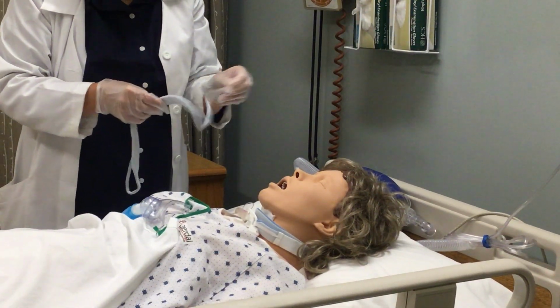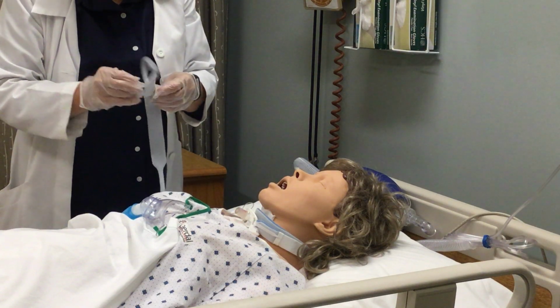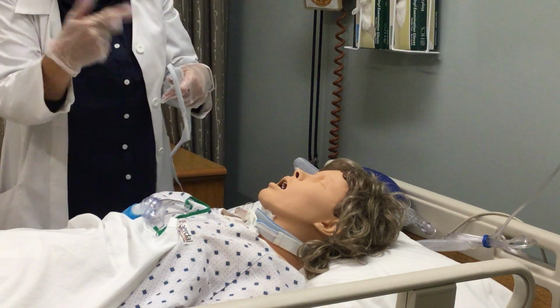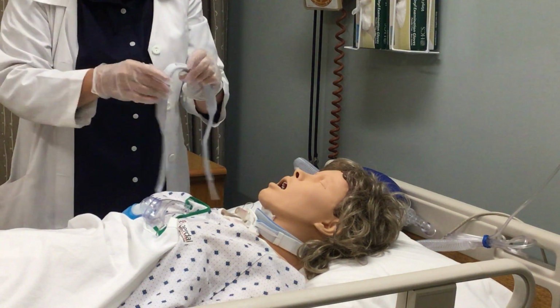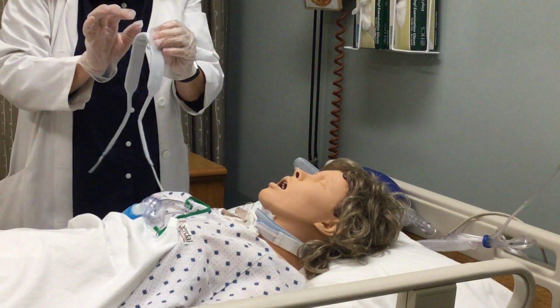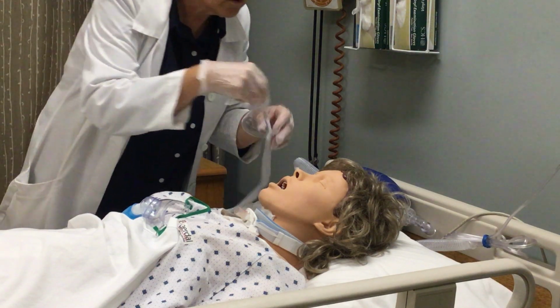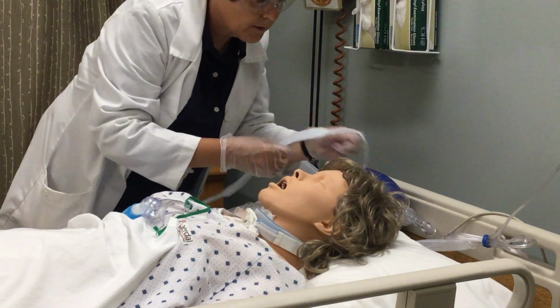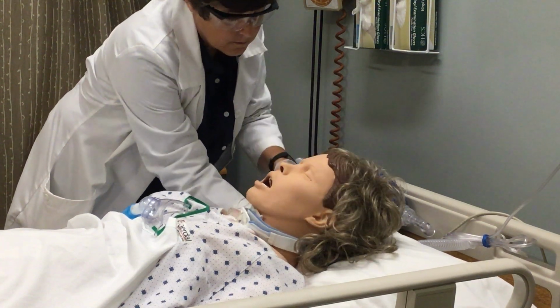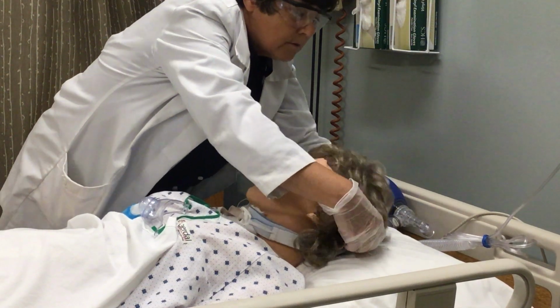In this case, since I'm alone, I'm going to first put on the new one and secure it to the side farthest away from me. If you're not sure how this goes, the Posey label, which is the name brand of this particular product, goes facing outward. Ms. Cruiser, could you please lift up your head? I will have to reach across to you for a minute. I apologize.